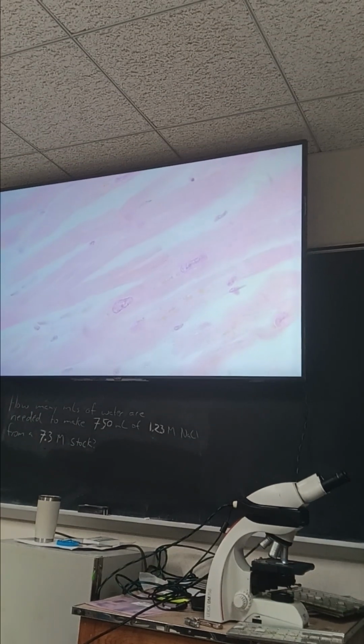What type of tissue is this? Okay, cardiac. Well, actually, let's look at it. What do we think? Yeah, I was going to say those nuclei are misleading. This slide has all three muscle types on it, so it doesn't tell me which one is which.